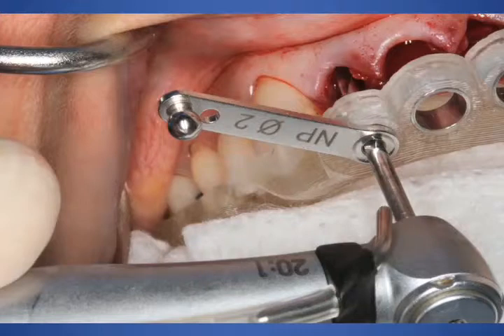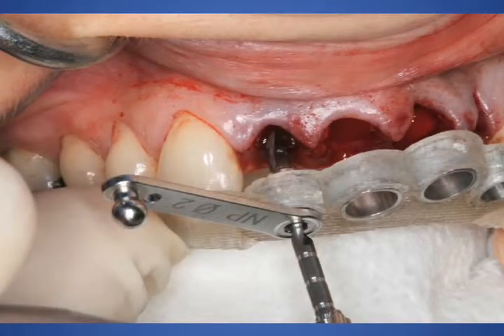So here we're simply placing a 2mm key into our 3.5 millimeter ring, and we're going to use our 2mm drill, initiating drill or pilot drill, to make our initial osteotomy. Now we've also predetermined depth of all of our implants, so we know exactly how deep we want each of the implants to be. We know their depth and their width precisely. It's a very precise system.